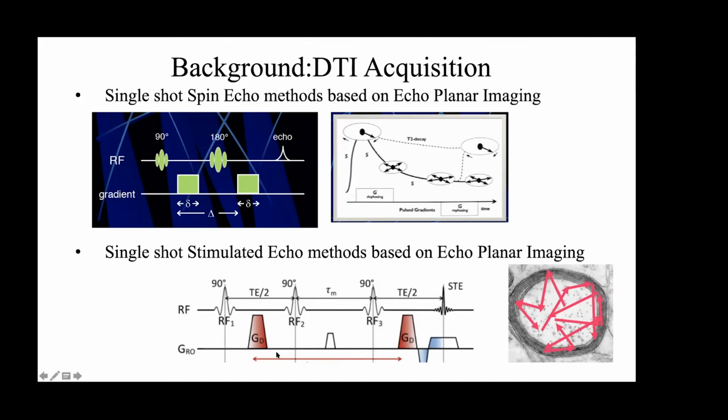And there's another way, but you can see that it's quickly decaying over here. That means you don't have much time to let the spins or the water molecules diffuse, and that's this diffusion time. So there's yet another sequence where you can preserve the diffusion and let it evolve for a longer time before you make the measurement. Compared to this, we can change the diffusion time over much longer lengths, including up to 500 milliseconds, and still be able to measure the diffusion.